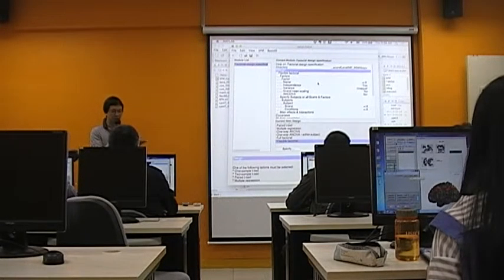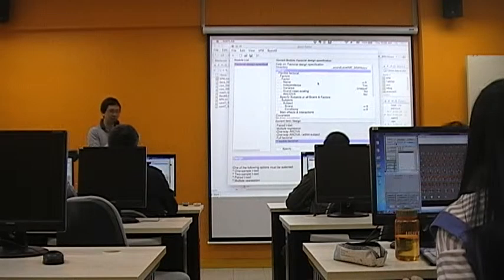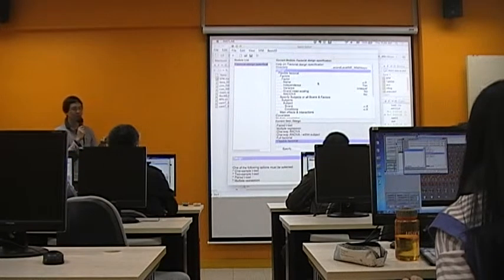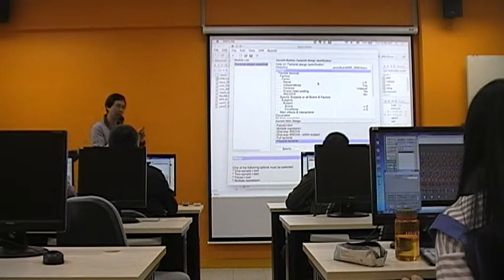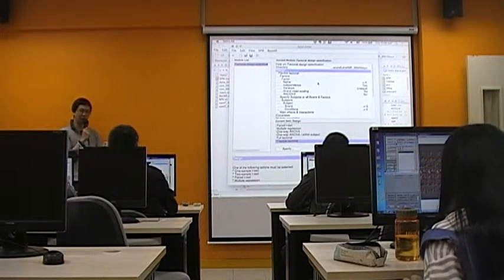We could model individual differences in this group. So we could specify a subject factor, which is a between subject factor. Then we could have another factor for the working memory, which has two levels. Okay? So you could have a one back condition and a two back condition. But this factor is within subject.